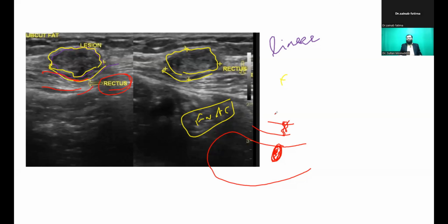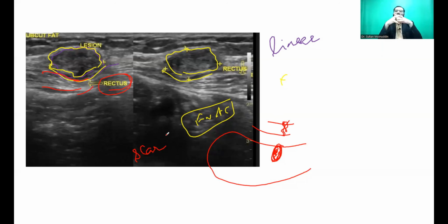That can be the term used, but sometimes when you speak about scar on the report, the only thing which comes in the mind of treating clinician is that scar means the uterine scar, correct? So whenever you are mentioning endometriosis, you have to be specific about the plane in which endometriosis is seen. So whether it's in the uterine body or whether it's in the proper subcutaneous tissue or in POD, ovary, etc.